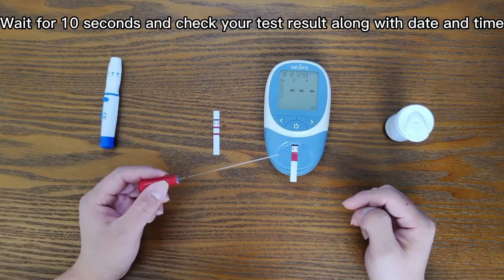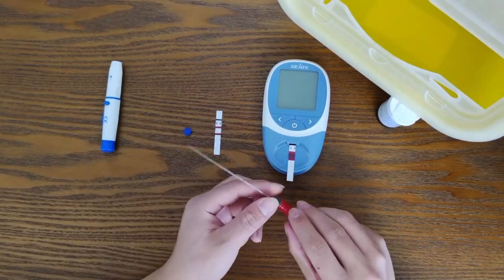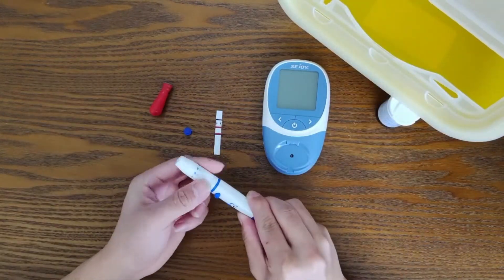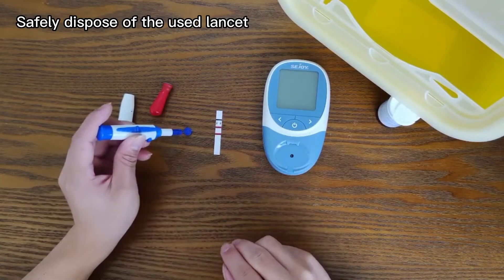Wait for 10 seconds and check your test result along with the date and time. Pull out the used strip and quickly dispose of it. Safely dispose of the used lancet.